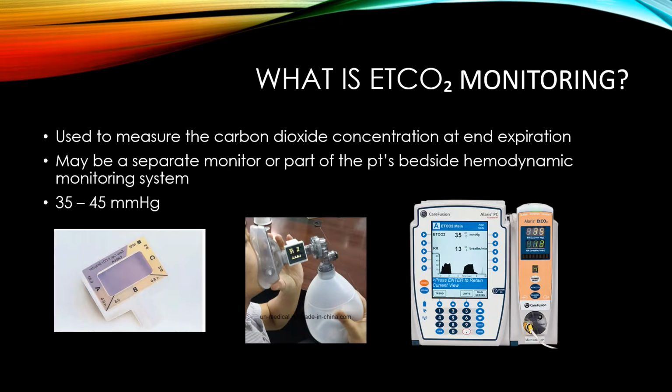There are different devices that monitor the end tidal CO2. If you look at the slide up here, the one to the right is our Alaris pump that we're very familiar with, that we do have at Tri-City. There is a chamber that you can attach. Instead of infusing fluids, it's your Alaris end tidal CO2 reading. Now, at Tri-City, I usually do not see a waveform on the main screen, as you can see here, but you will see the reading, which, if you look at this one, this client's end tidal CO2 is 35 millimeters of mercury.